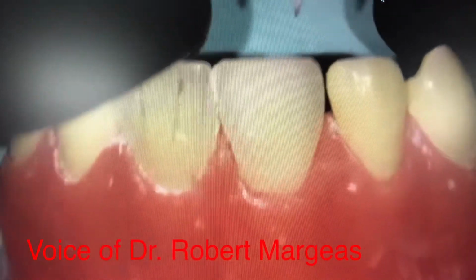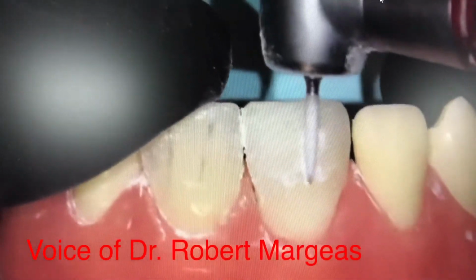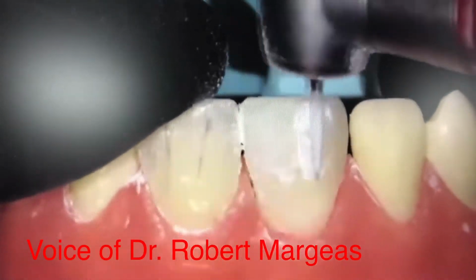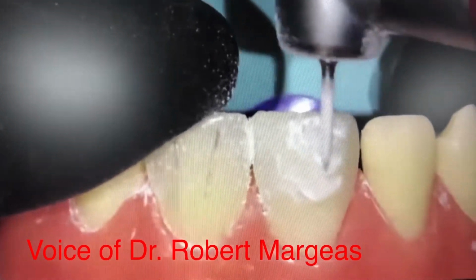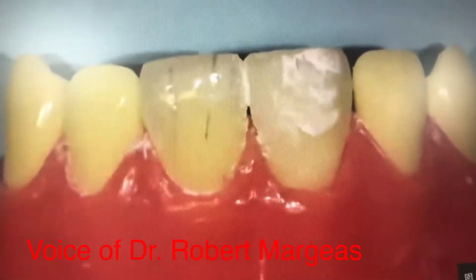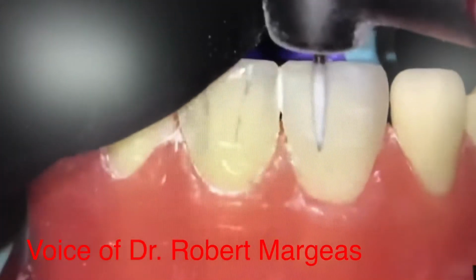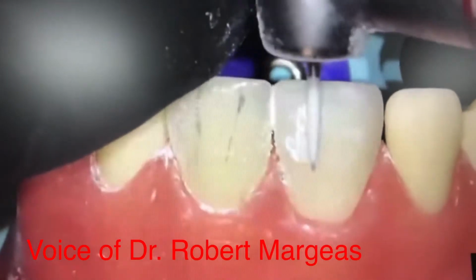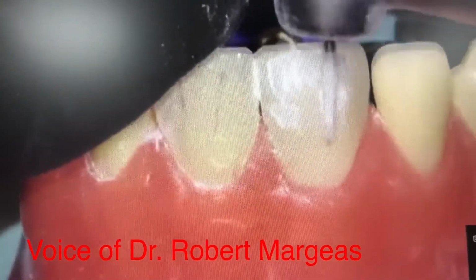Slow speed to create a little depression. And then I'm using a little bit of pressure here. Because if you don't have a lot of anatomy, then you're just going to create this. If I don't have a lot of anatomy, I'm just creating what I see on the adjacent tooth. I don't have a lot of finishing and polishing to do.